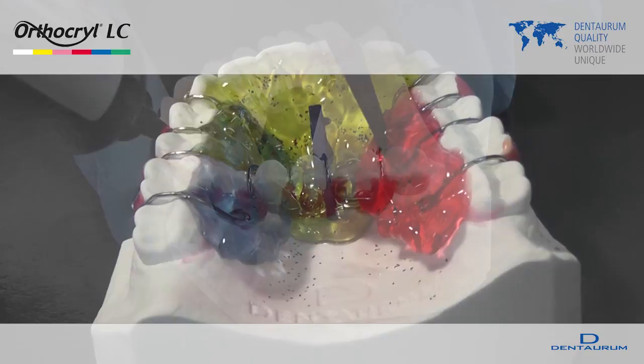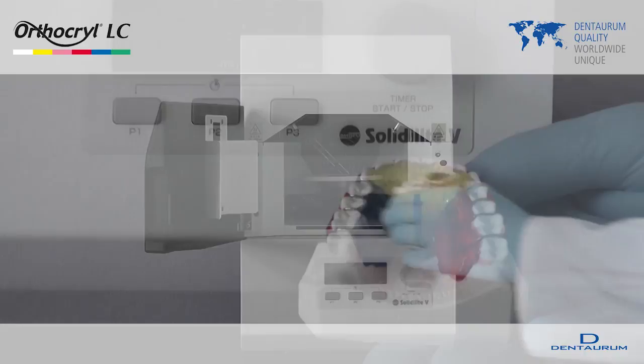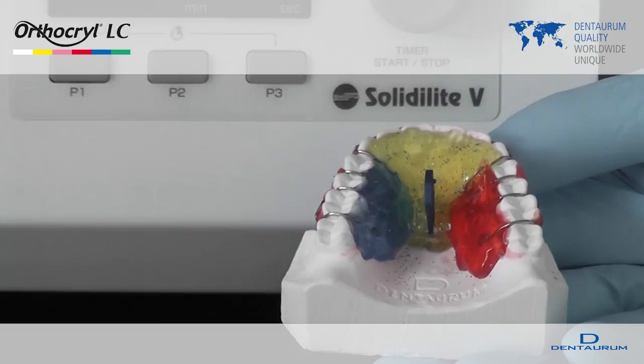In the next step, OrthoKryl LC is applied until the appliance has both the shape and the thickness required: upper jaw approximately 3 mm, lower jaw approximately 4 to 5 mm. The appliance is now finished and is cured in the light curing unit.